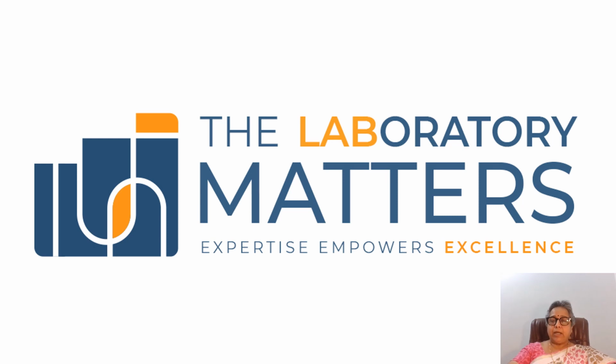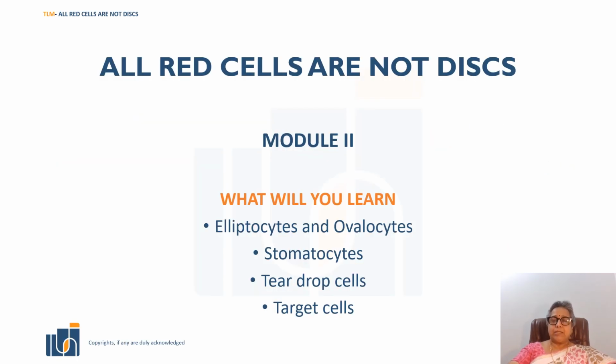I'm Dr. Rani Radhakrishnan, and today we're going to discuss the second module of our series, which is titled All Red Cells Are Not Discs. In the previous module, we saw the definition of a poikilocyte, why poikilocytes are created, and we also discussed the spiculated cells.